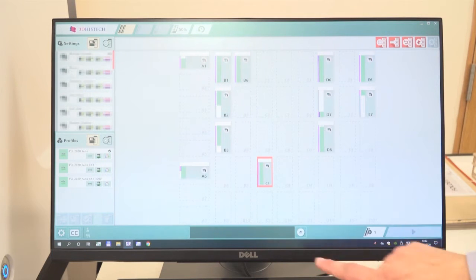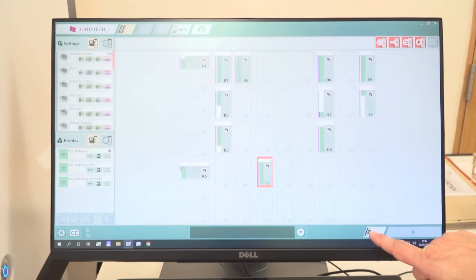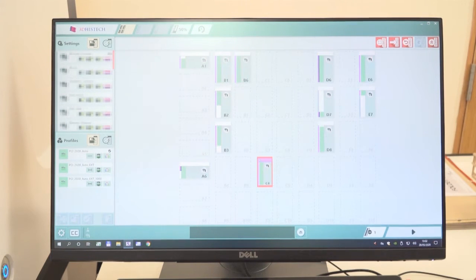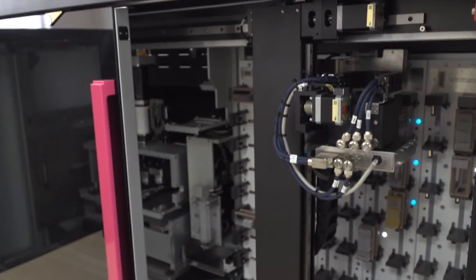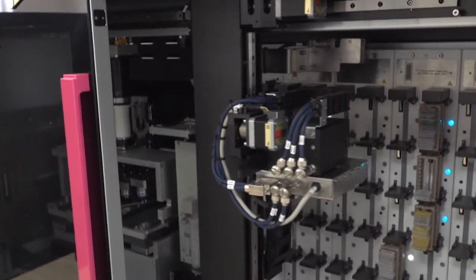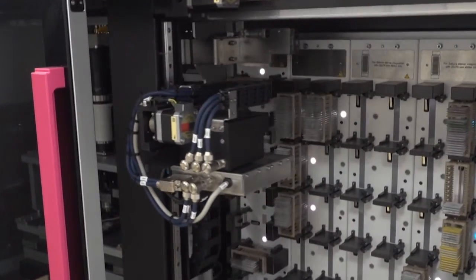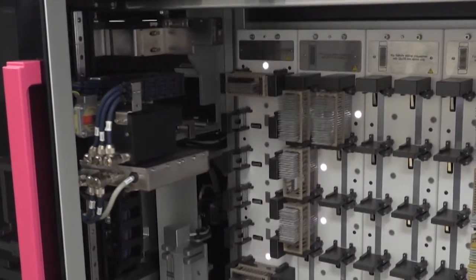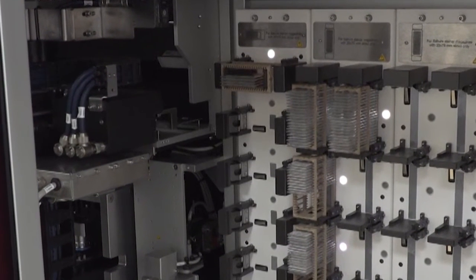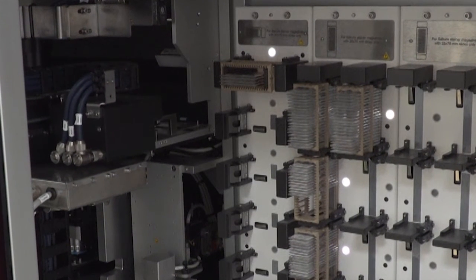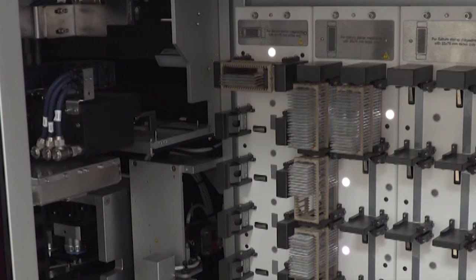To scan, press the Add Rack button, so the rack is added to the scan queue. Press Play to start scanning. The scanner will go to the first slide of the first rack in the queue. It will take the slide to Preview.